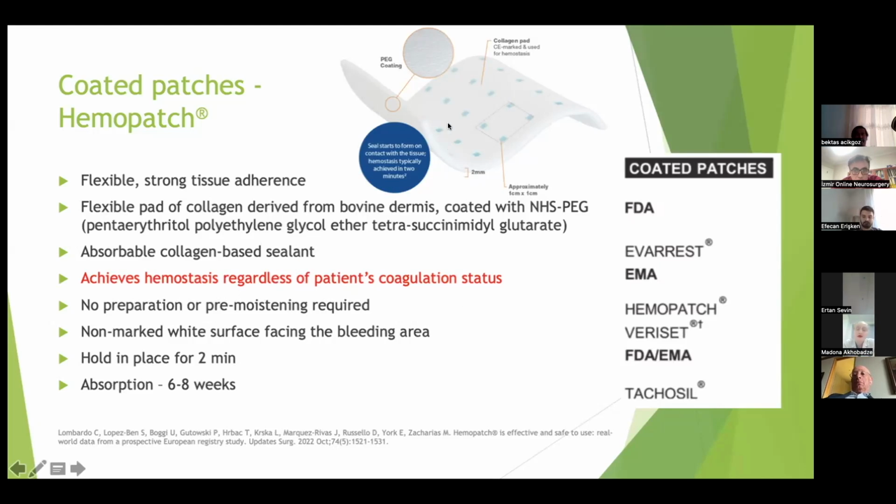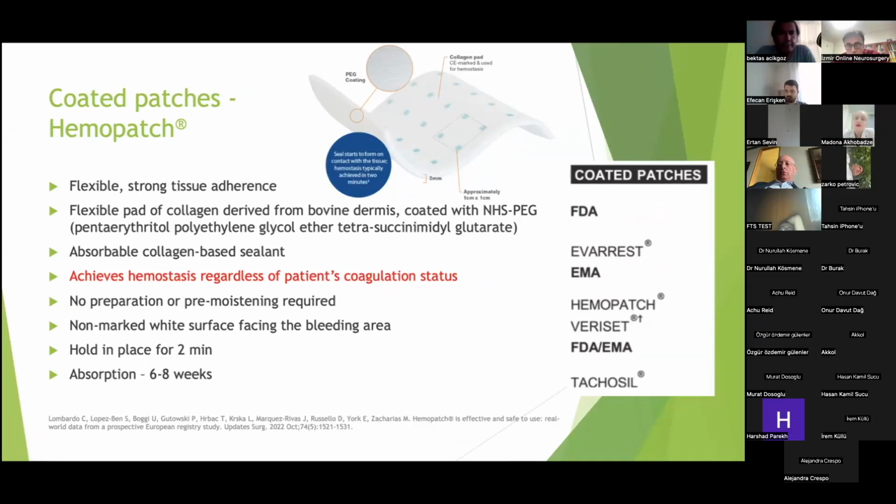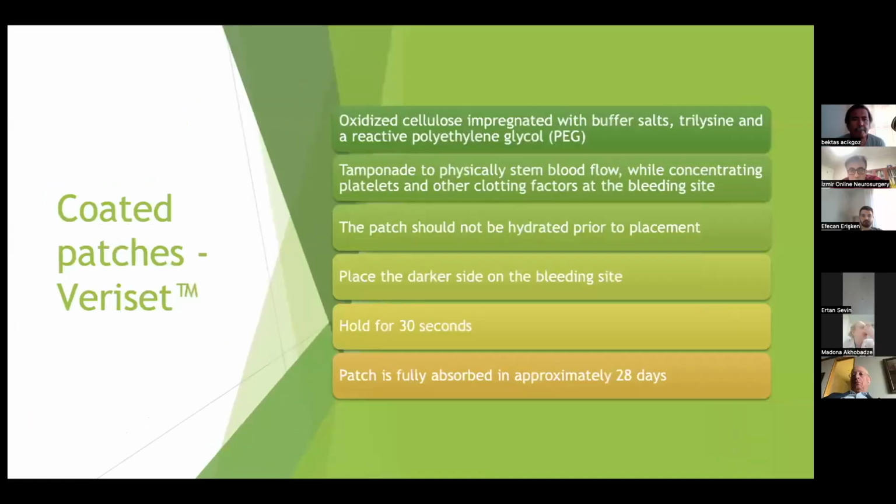And you can see there are two surfaces. One is with blue dots, and the other one is white. So we have to apply the non-marked white surface over the bleeding area, not the other way around. So this surface should be facing the wound. And it has to be held in place for 2 minutes, and it gets absorbed in 6 to 8 weeks' time.